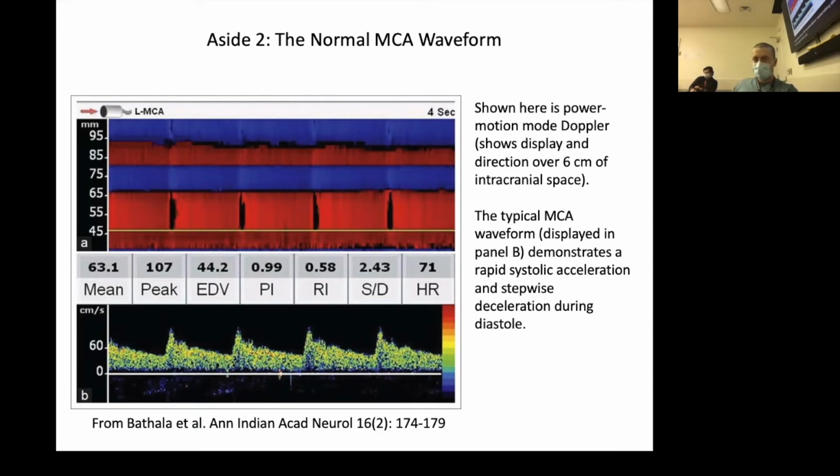For the most part, transcranial Doppler as you see it officially, if you were to order transcranial Dopplers in this hospital, and we only have actually one neurosonologist that does this, Carol, they use a different kind of machine, and they use what's called power motion Doppler, which is basically a multi-gated M mode.